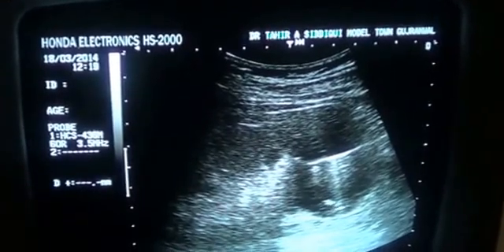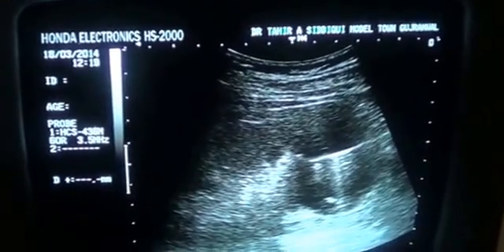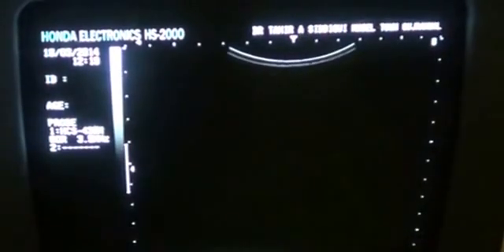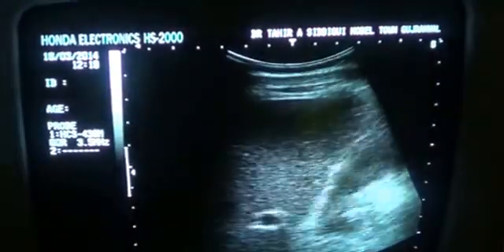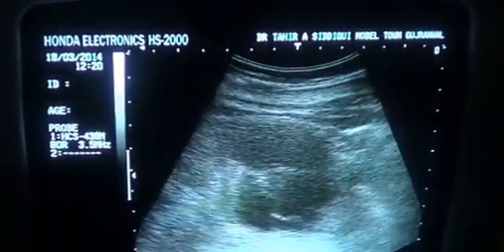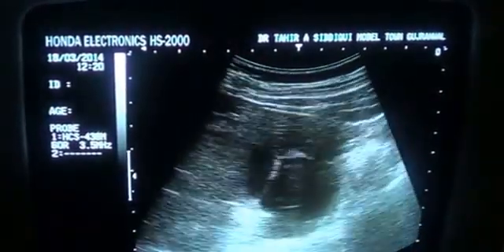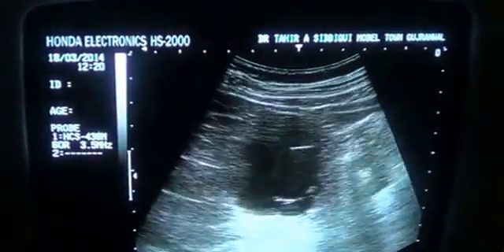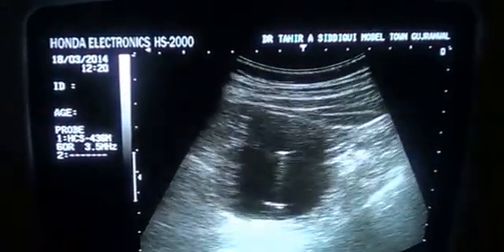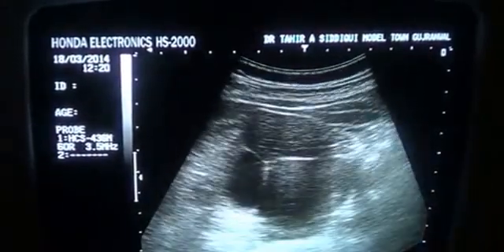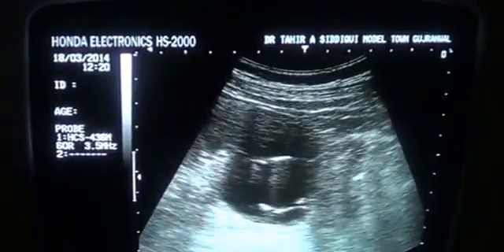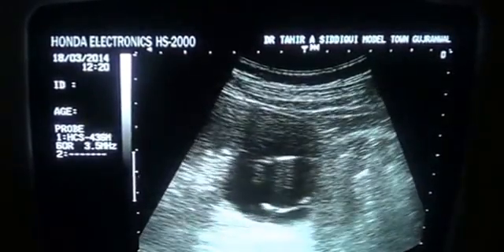This is the air shadow. There are tiny calcified areas at the dependent region and there is no solid element within it seen. I am showing you a magnified view of this cystic area with internal septations and fine dependent region.